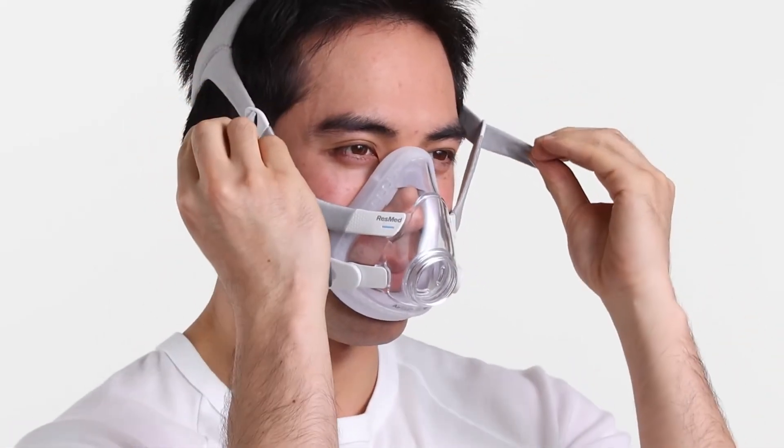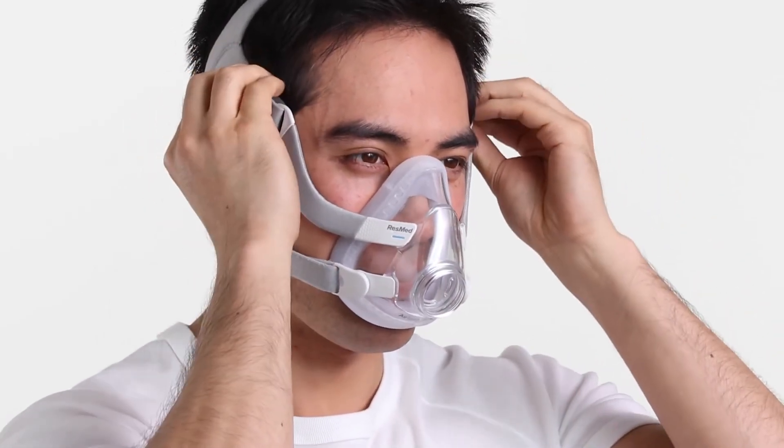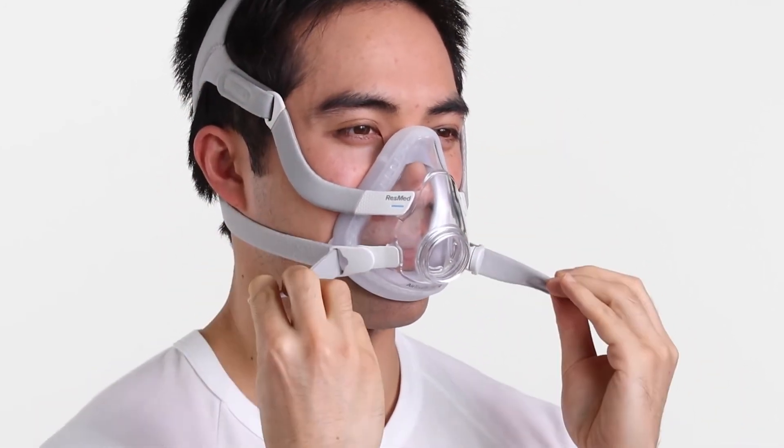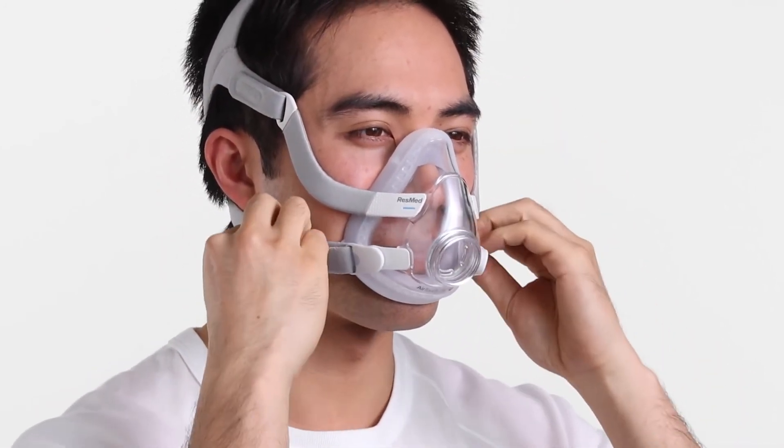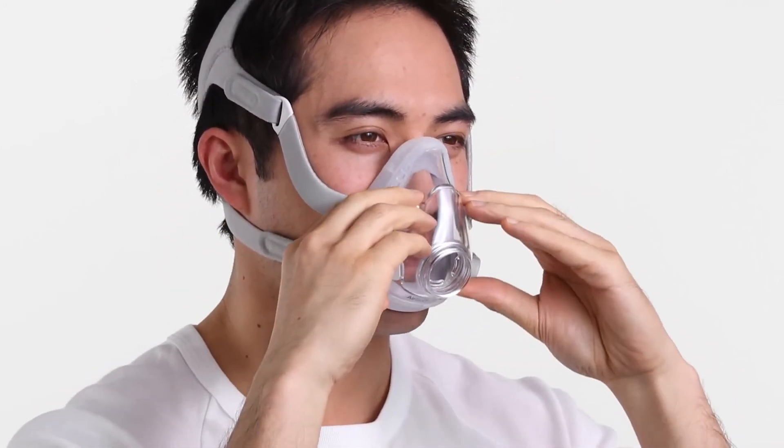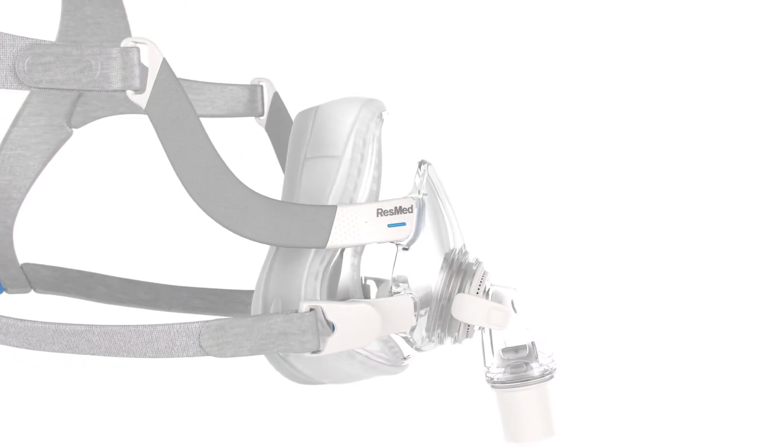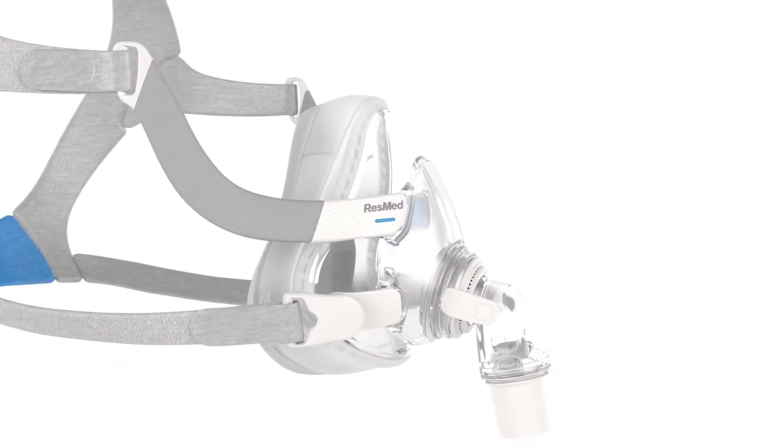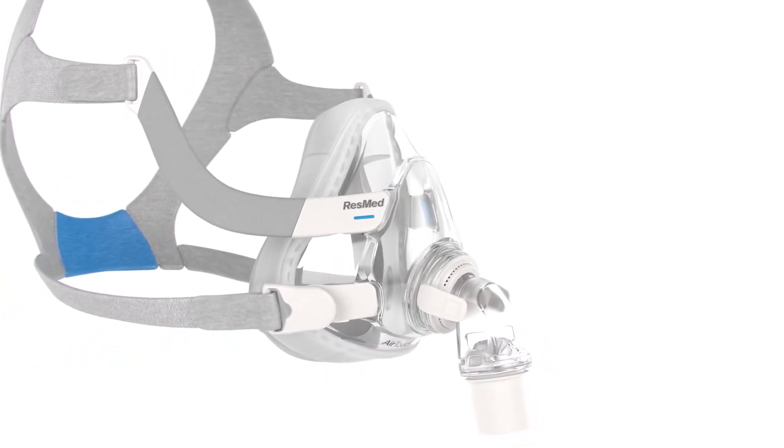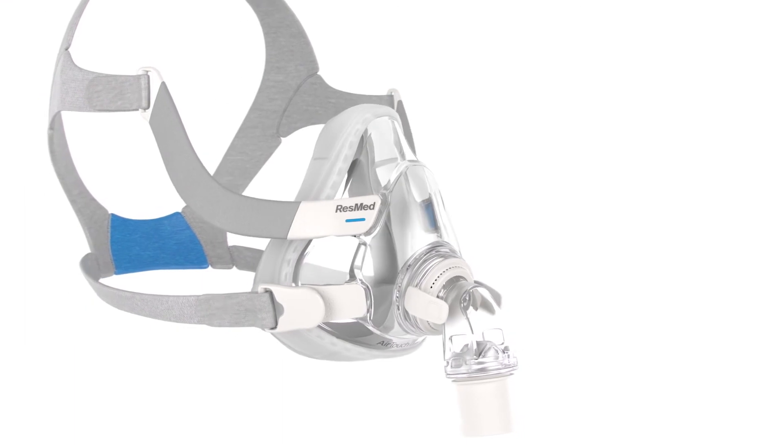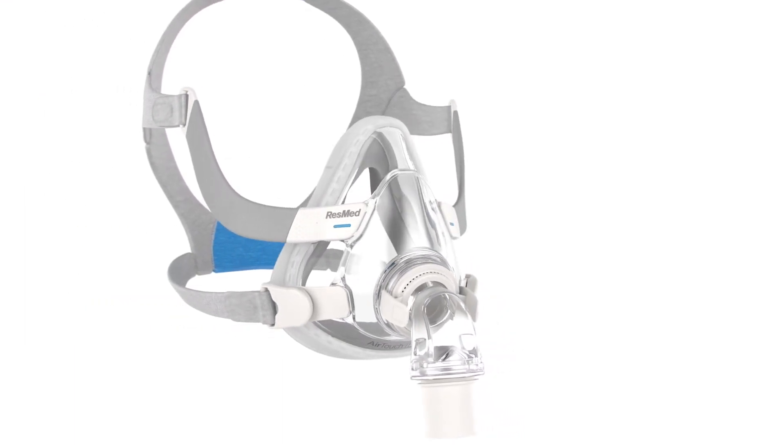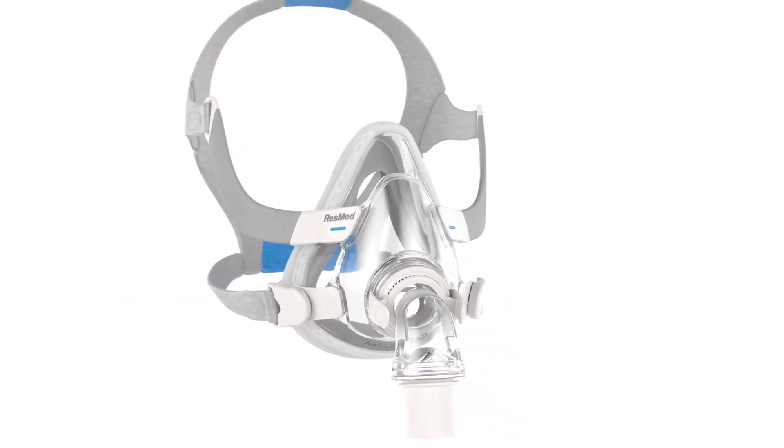Too often, comfort has proven an obstacle to therapy compliance among patients. With the softer material of ResMed UltraSoft Memory Foam, Airtouch F20 offers patients greater support, delivering outstanding seal performance with crucial pioneering comfort.